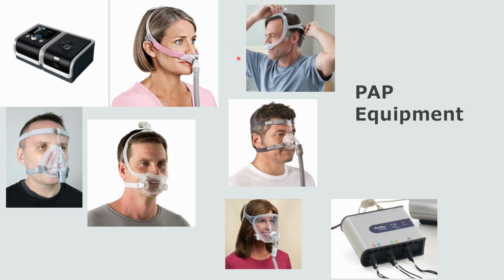If you look at the full face mask and the nasal mask and the pillows, you can see that there's a lot of extra space in that full face mask. And we call that dead space. That dead space has to be pressurized, and most of the time you need an additional 2 to 3 centimeters more pressure to get the patient fixed on those masks when compared to a nasal mask. That's something to keep in mind. Patients have prescriptions for masks for that reason. If they're set for 8 centimeters on a nasal mask and then they switch to a full face mask, it's not going to be enough. They need more like 10 or 11.